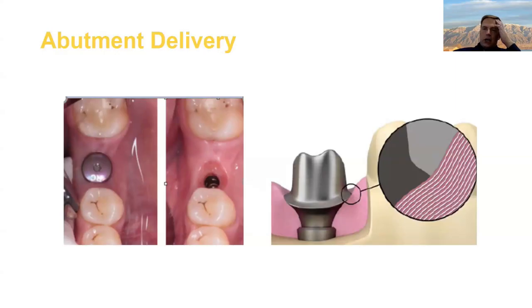So we can just double check our occlusal clearance. The other advantage of doing that is that you can make a provisional on that, and at least the patient's going home with a tooth, not the final tooth. It's not ideal, but at least it gets you further along. So that can be a little trick. Hopefully you never have to use it, but good to know.